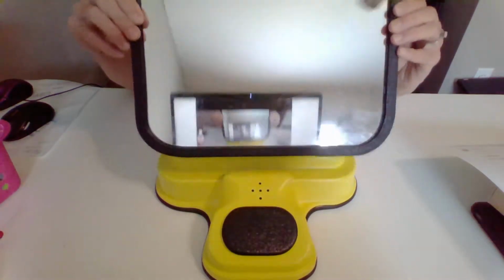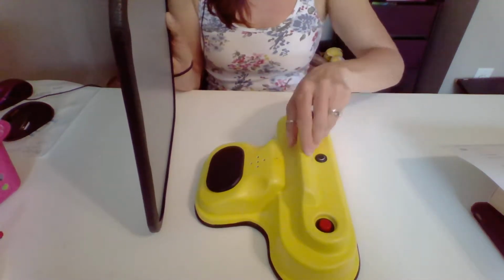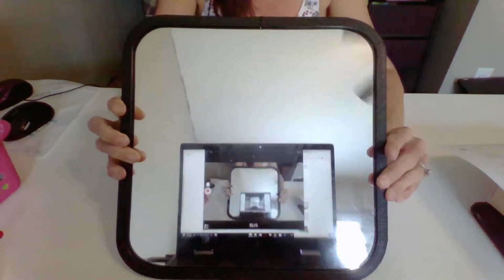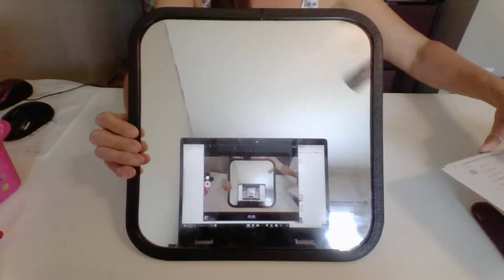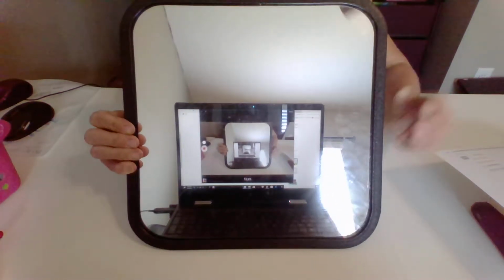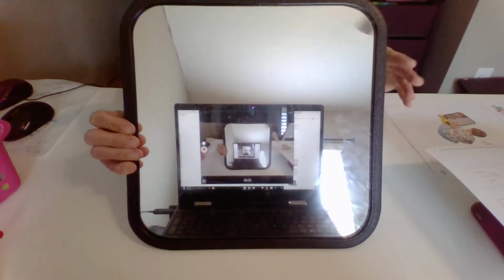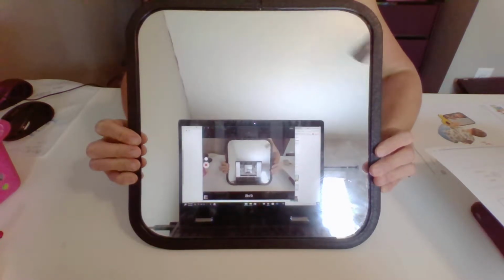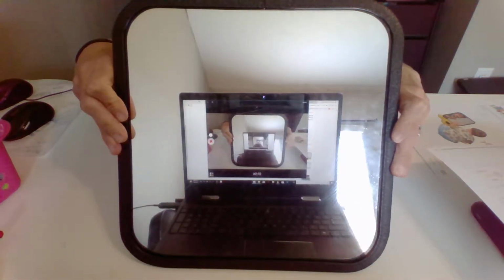Okay, so you have two pieces to this device or resource, and you have a base, which is yellow in color, and a mirror. Now this mirror is 12 inches by 12 inches in length and height. It's a perfect square. It is made of thick acrylic, and they're claiming it is unbreakable. It is 1/4 of an inch thick, and I've had this probably over a year, and indeed it has not broke.